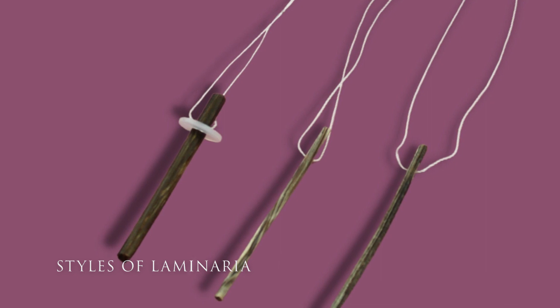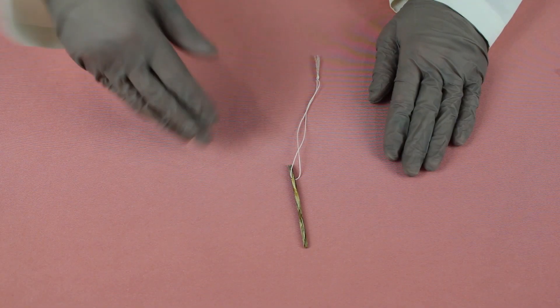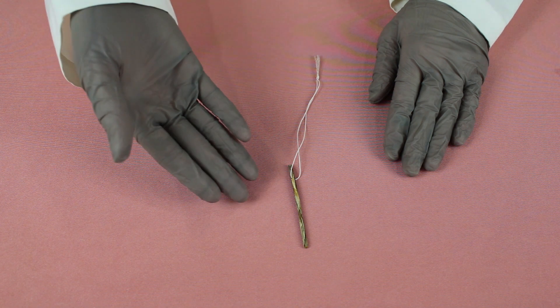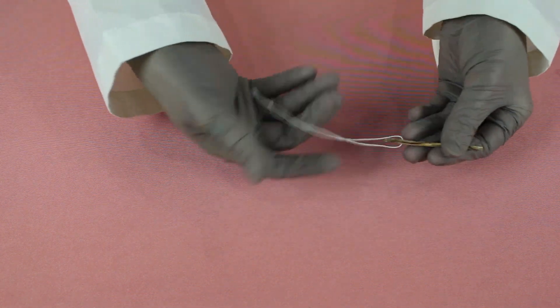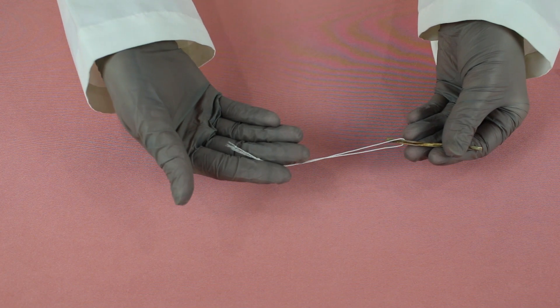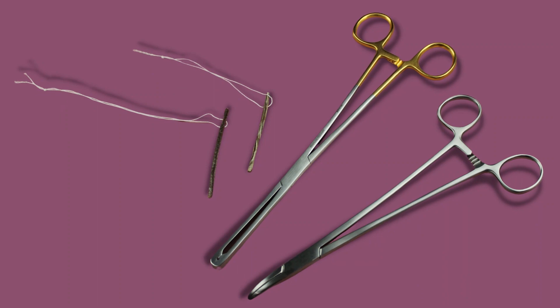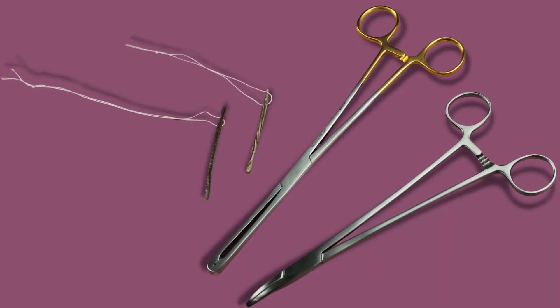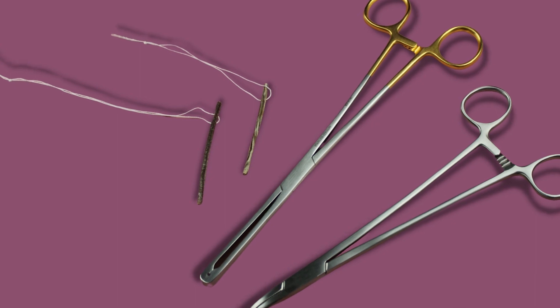As you can see, the regular Laminaria comes in a variety of diameters. Let's look more closely at the 5mm stick. It has a string attached for aid in locating the Laminaria, much like an IUD. It can be inserted into the cervix with a Laminaria inserter, which has a special slot for the Laminaria stick.